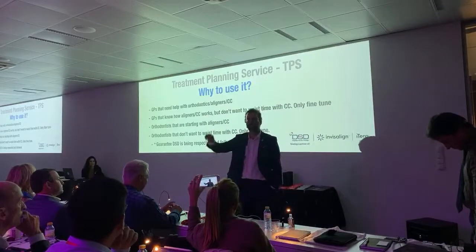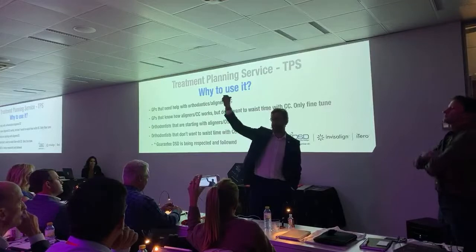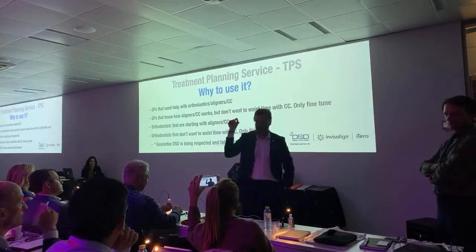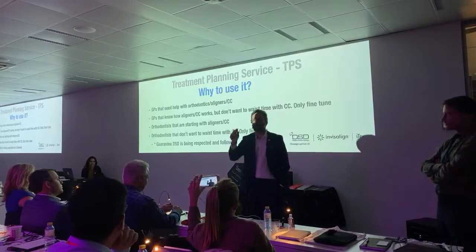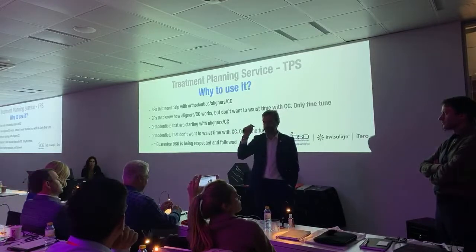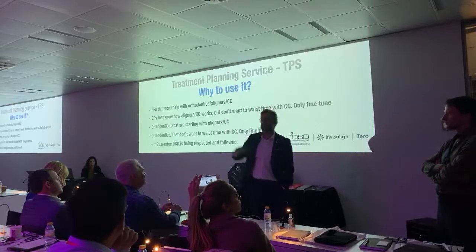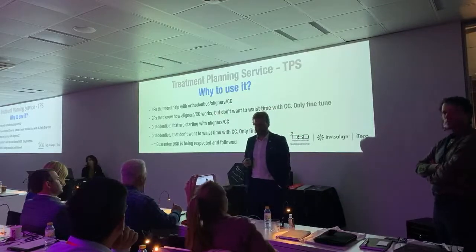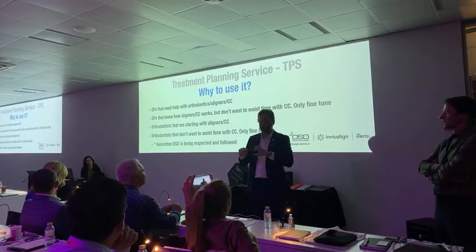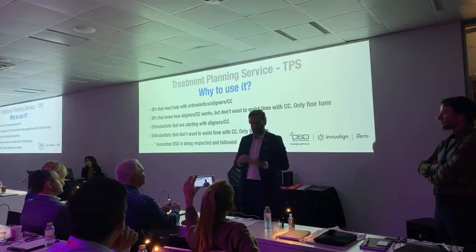Once this is approved, you're going to order the Invisalign the same way. Select DSD collaboration. The case goes to Align. Whenever the case goes back to you, the first ClinCheck, whenever Costa Rica sends the first ClinCheck to you is when you can activate TPS and this case comes to us. So it's like you entering ClinCheck to see how was the first ortho from Costa Rica.